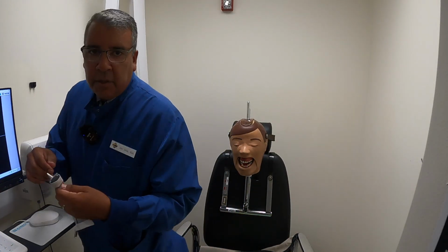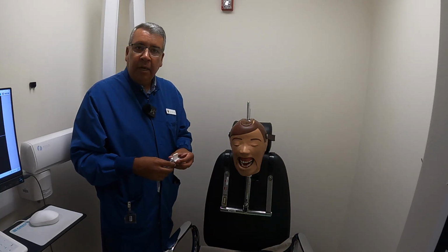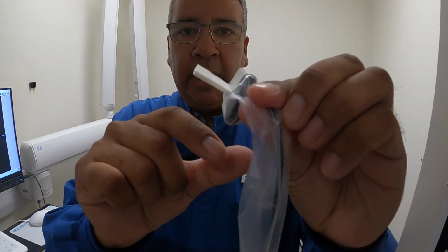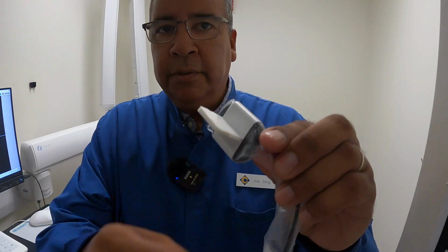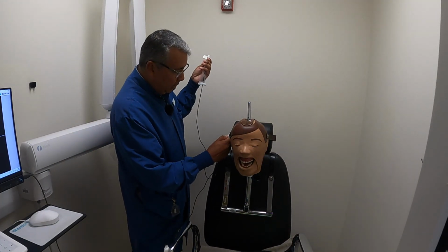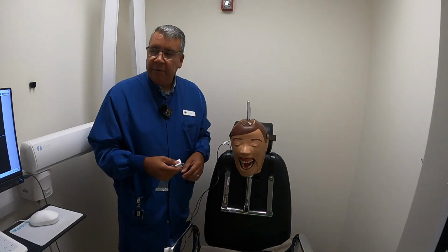Okay. So, can you look at the back of that so I can make sure I'm still in line? Good. Remember to show it to the camera. Yeah, so this is the final product, thank you for saying that. We have an equal amount on top, an equal amount on the bottom, and the tab is now on the flat portion. So I'm going to put it right back on here just in case I make any mistakes. It's going to fall not to the floor.